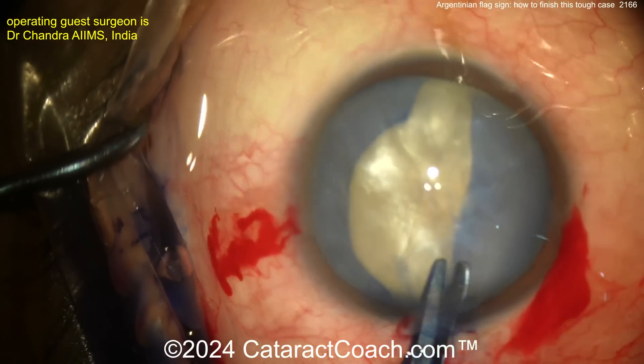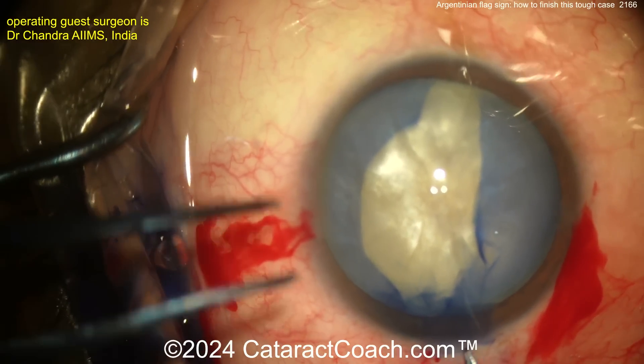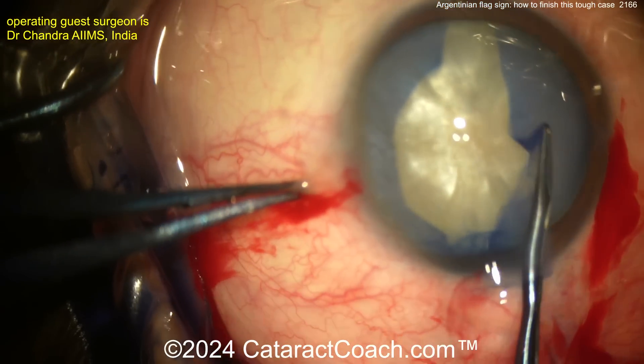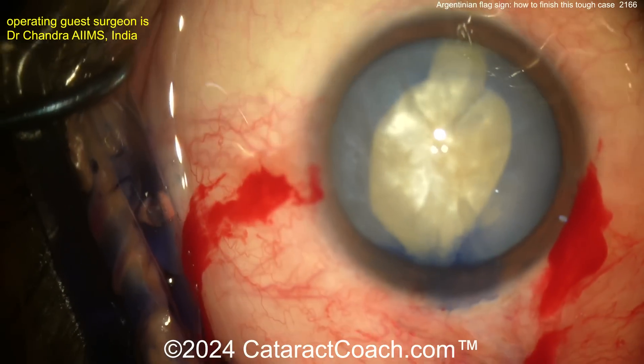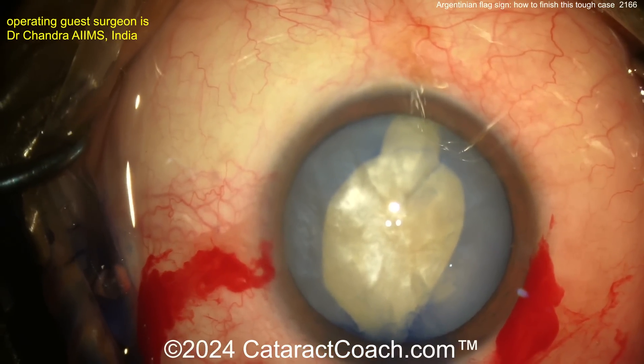You can access the cataract. But how do you get out the nucleus without putting stress on that capsule? How do you prevent this from splitting further back? There's a semi — that's a bit of a rhexis there. It'll work. You've got no choice. It has to work.